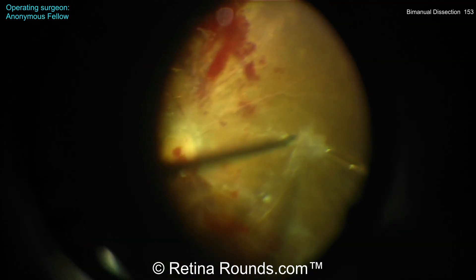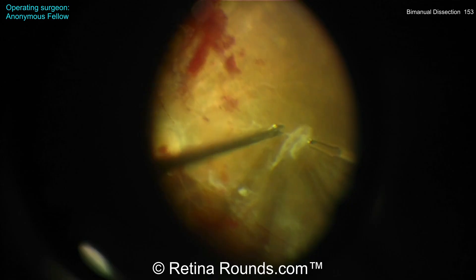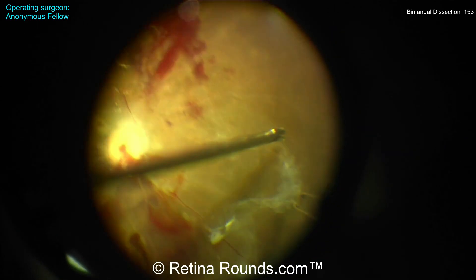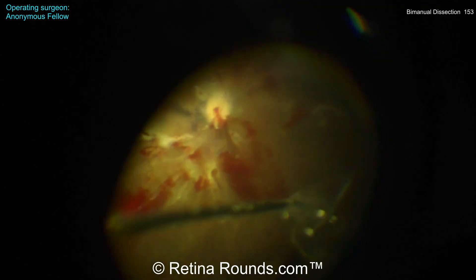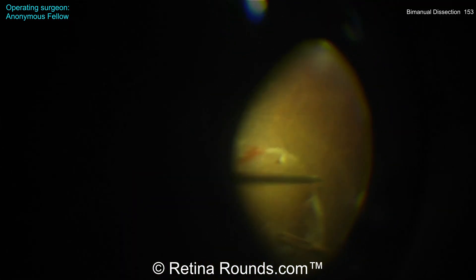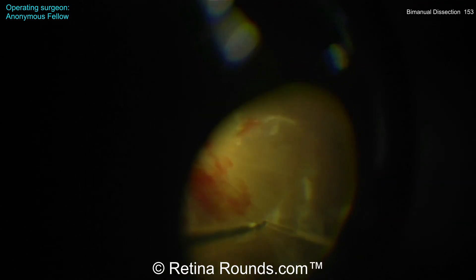I like the use of the closed scissors to bluntly dissect to create space and then the open scissors to actually cut these fibrovascular membranes. You just have to make sure that the orientation of the scissors is as flat as possible. The more vertically oriented the scissors are, especially with a posterior-to-anterior approach, the more likely you will get an iatrogenic retinal break.